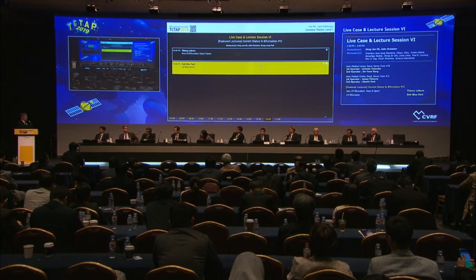So in my center it is angio, but the reference diameter is estimated according to the normal part of the vessel. Sometimes we don't know the size of the vessel because it's diseased. So we can calculate, and this is what we do every day. If we know two references, the proximal main vessel and the side branch, then we can calculate the size of the main branch. On the opposite, if you know the main branch, and we had the discussion in the previous cases about what should be the size of this left main, you have the reference of the LAD and the reference of the circ, and then you can calculate. In this case, I think it was about 4 millimeter, but we measured it by IVUS, it was 3.5. So in my opinion, we should have increased the size of the stent in the left main in order to follow the anatomy of the patient.